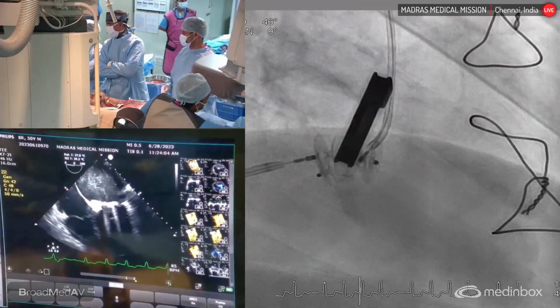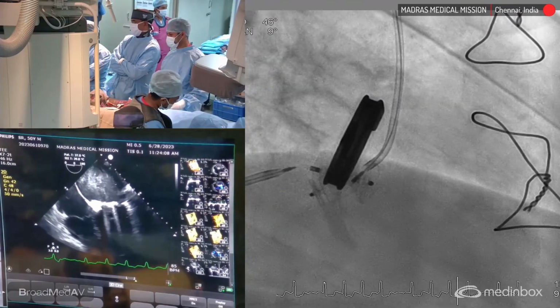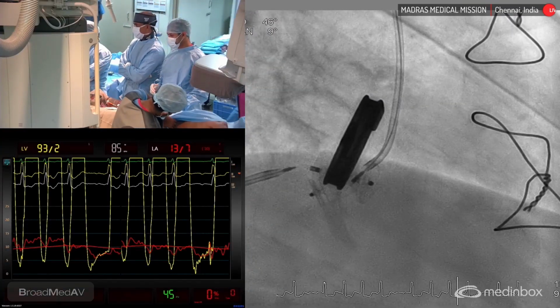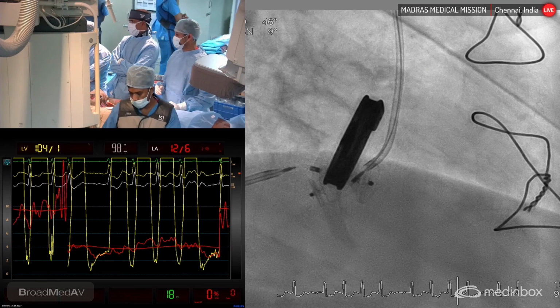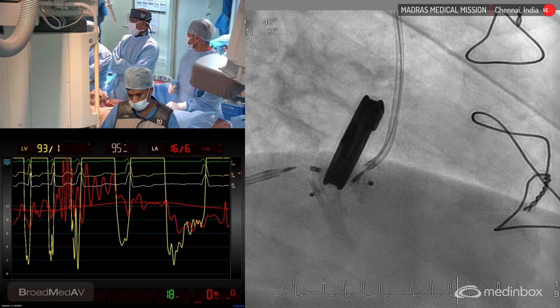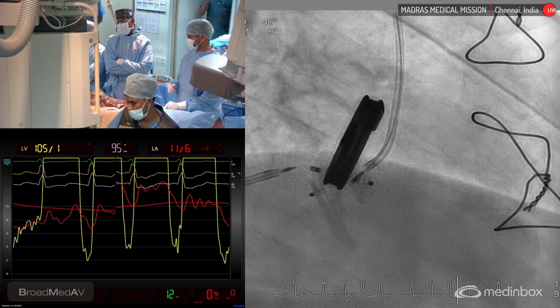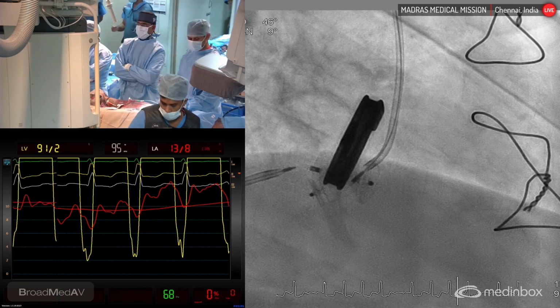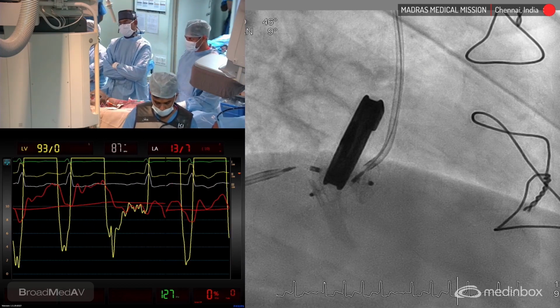So get the transmitral gradient on, put it on. Actually, the left atrial pressure has come down from the starting of the procedure, somewhere around 15 millimeters of mercury, now to around 10 millimeters of mercury. Put it on 10 scale, increase the speed. Now we are able to see that there is hardly any transmitral gradient. So the valve functioning is good.